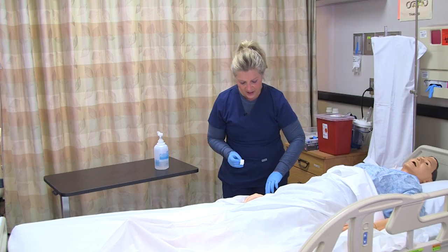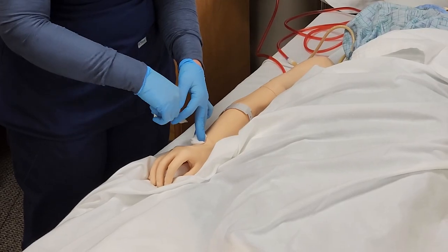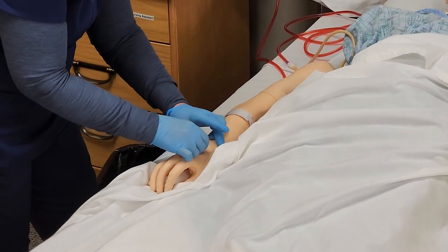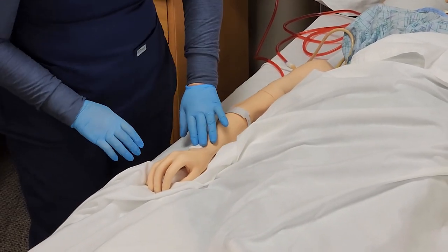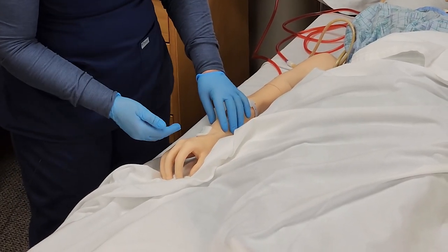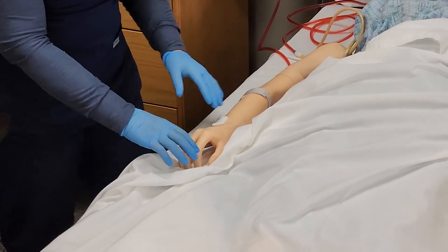I'm putting pressure on the gauze and now I'm going to get some tape ready to secure it. I go ahead and secure the gauze. In some instances, you can also wrap it with a coband to hold it in place, but in this case I'm just taping it.